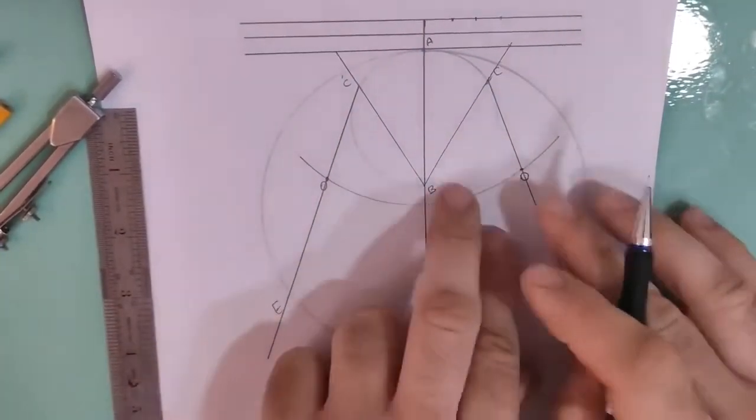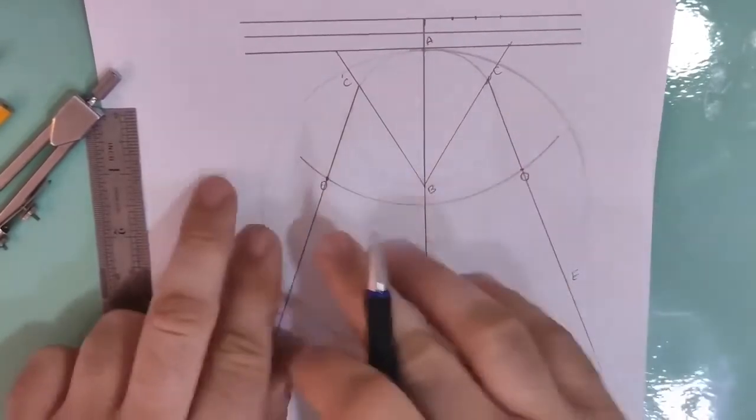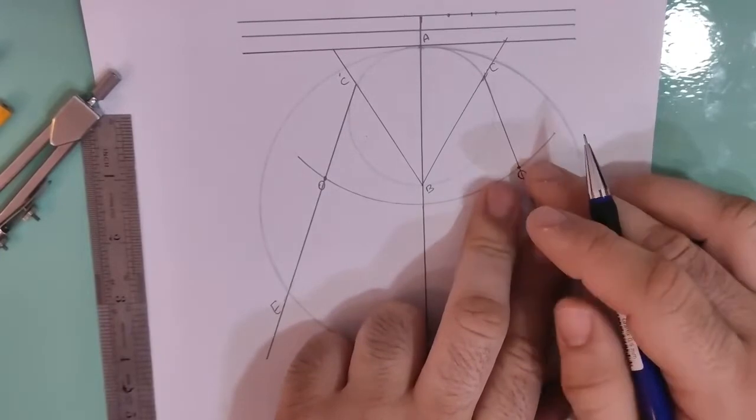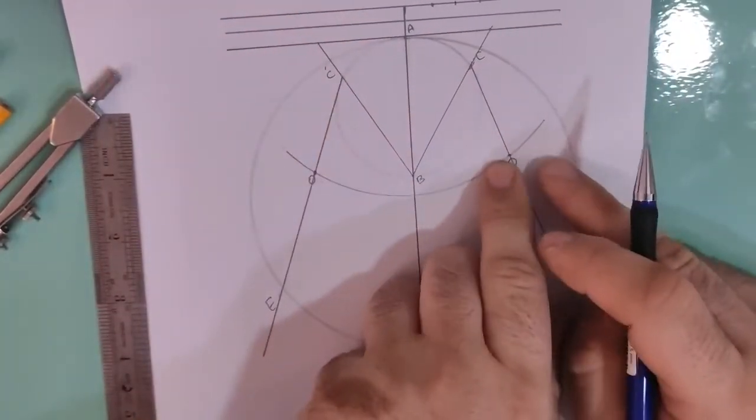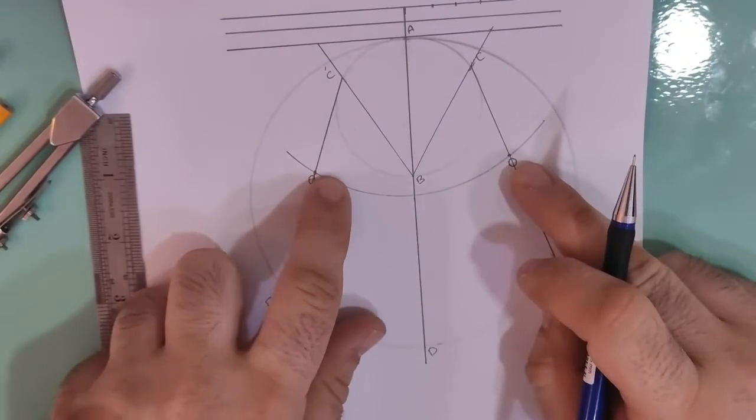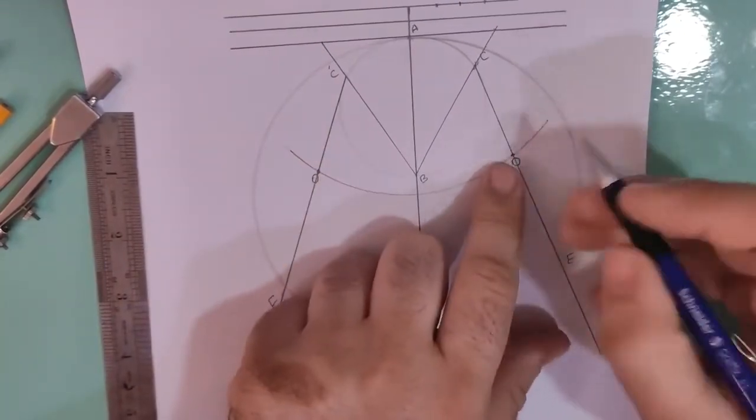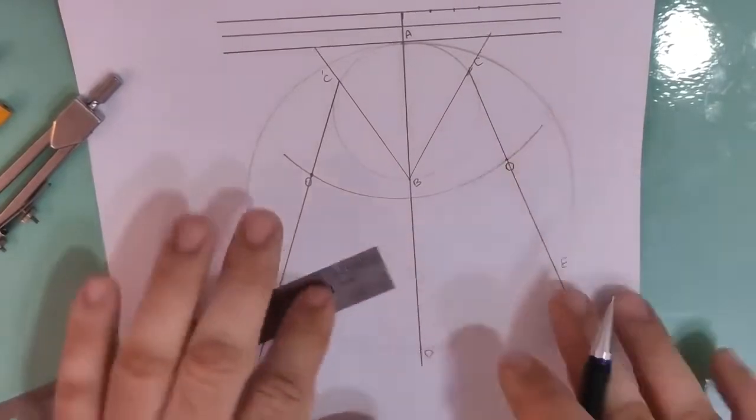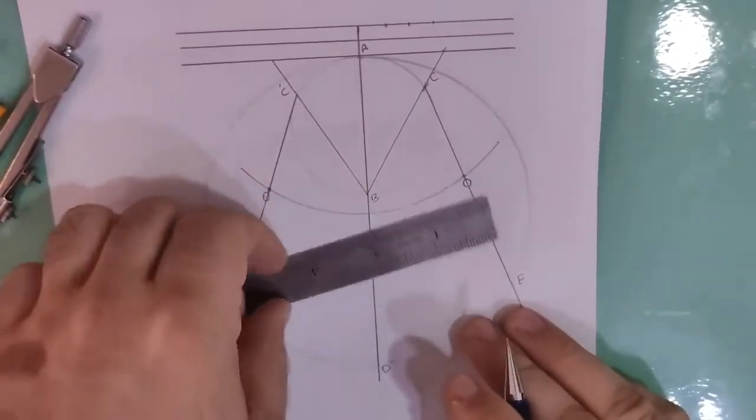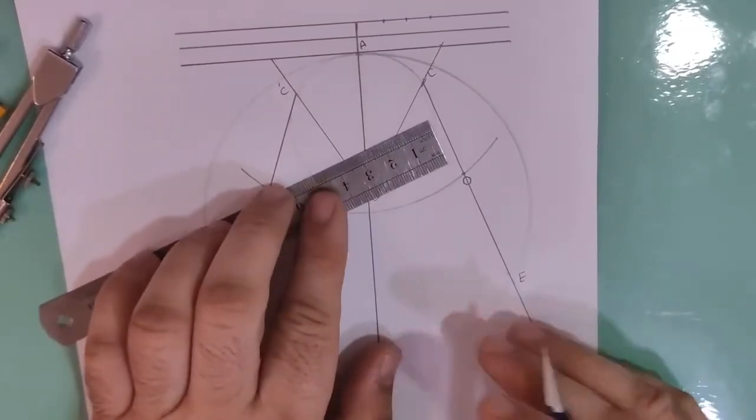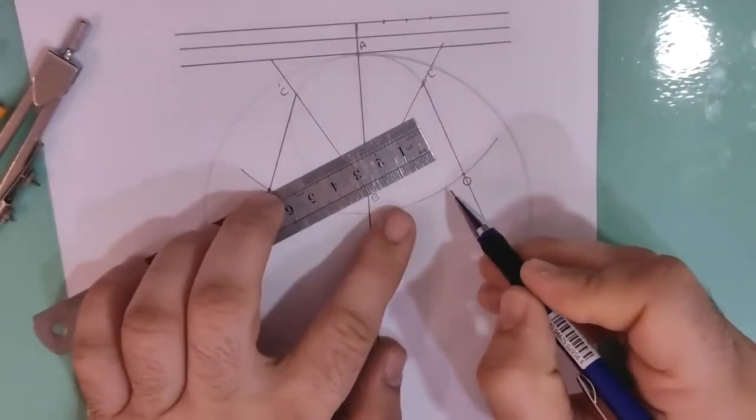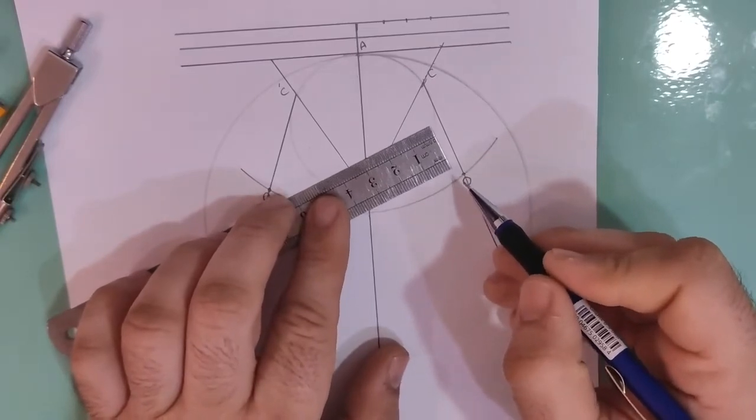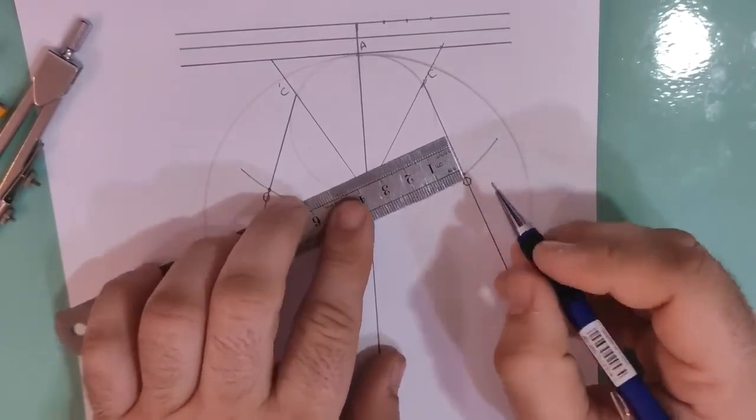Now we have four points on this side and four points on this side. It's like a mirror. The point on this side just like the point on this side. So we first determine point one. We called it one. Point one, its distance from zero, is six point five millimeter.